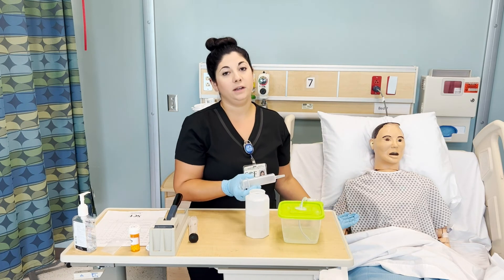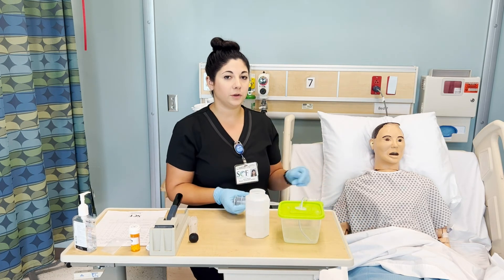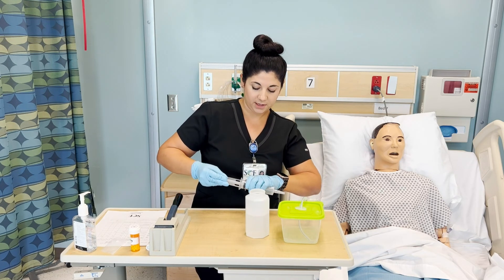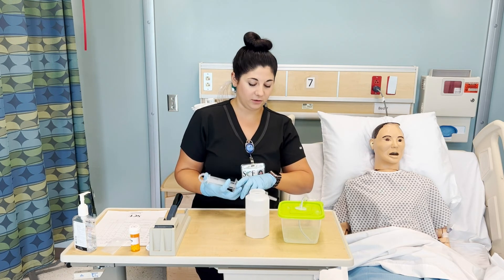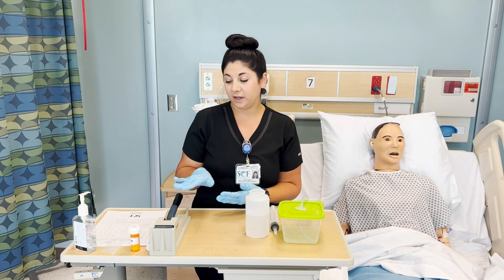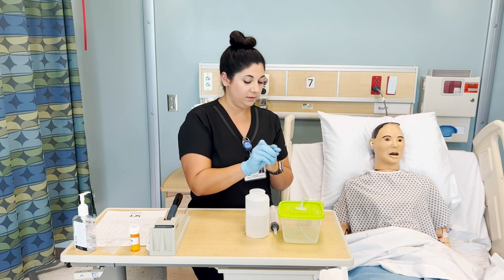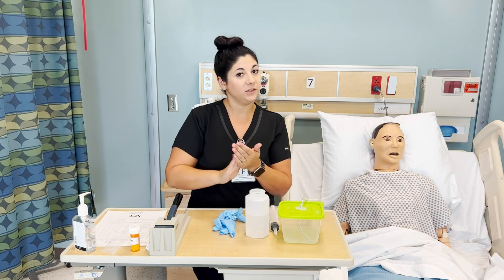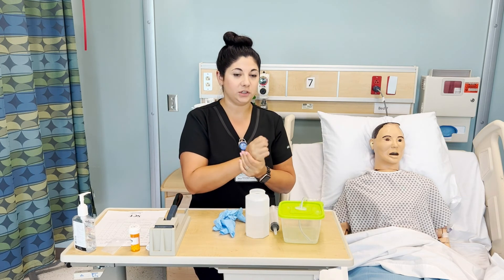We are going to keep our patient in a high Fowler's position for at least 30 minutes after instilling medication. Then assess that they're feeling okay, that they're not nauseated, and that they're tolerating the medication well. We'll document that the medication was given, take off our gloves and wash our hands, make sure our patient doesn't need anything, and that the bed is all the way in the lowest position.